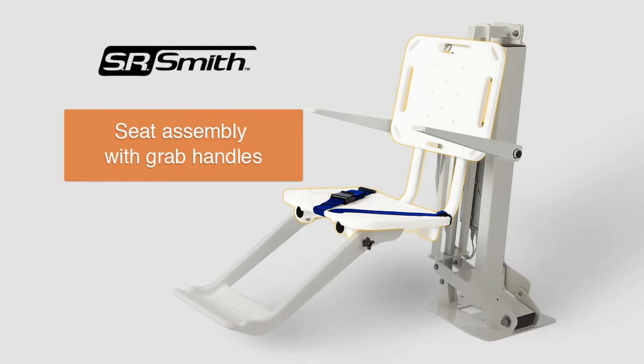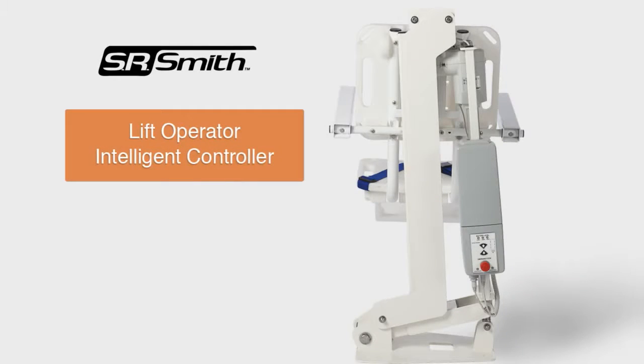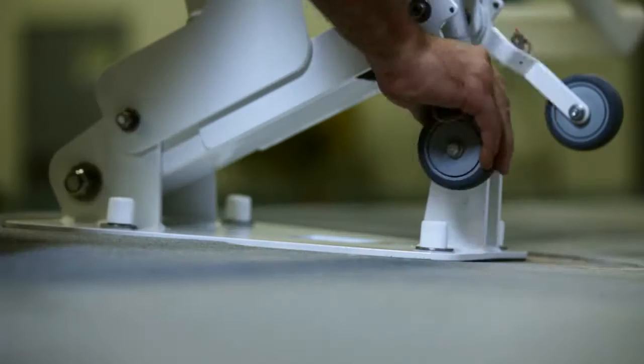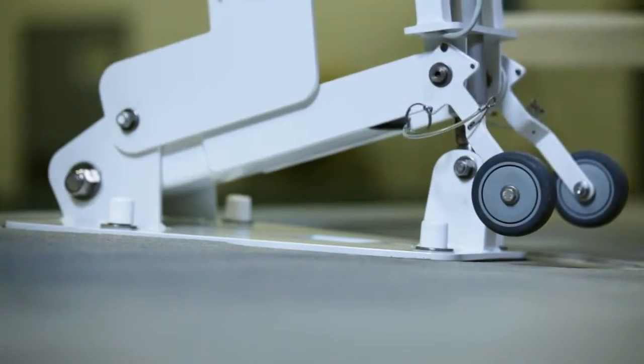The multi-lift includes a seat assembly with grab handles to ensure safe transfer, a footrest, a seat belt, and a patent-pending lift operator intelligent controller. Options include arm rests and the wheel away mobility feature that allows the multi-lift to be easily removed from the deck.